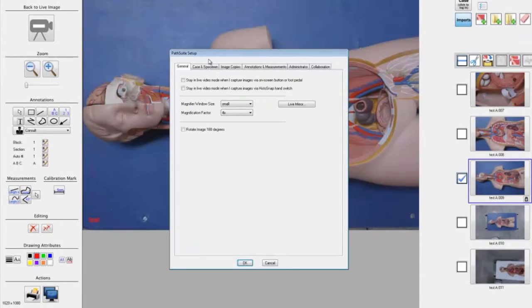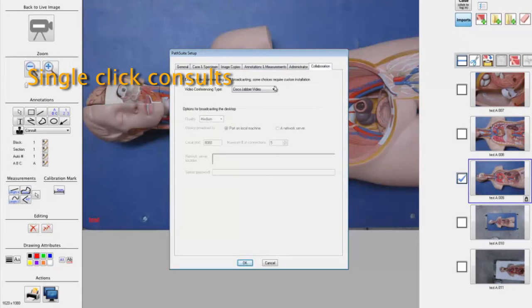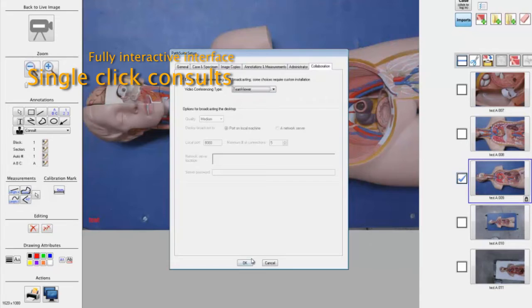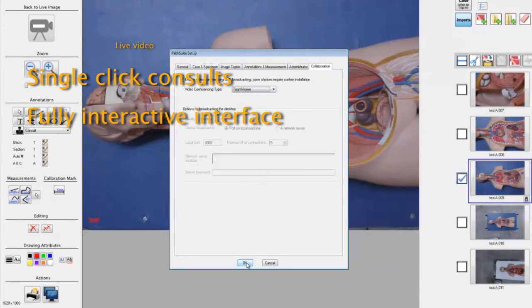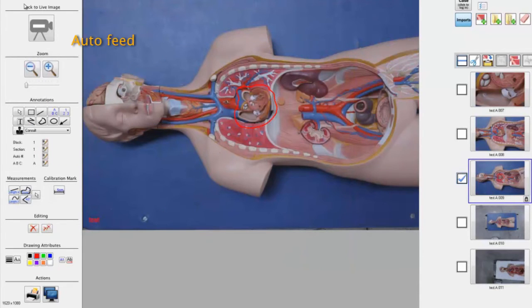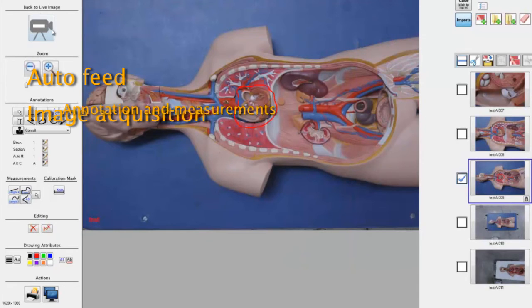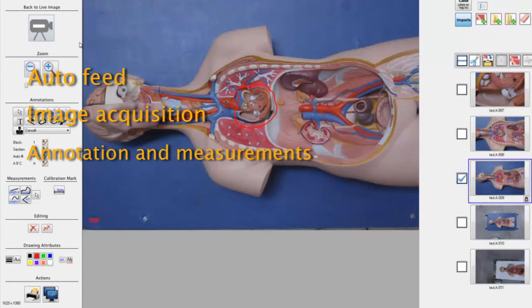PathSuite's telepathology interface provides single-click connectivity consults with specialists down the hall or across the country. As a fully interactive interface, all features are shared including live video, audio feed, as well as control of image acquisition, annotation, and measurements.